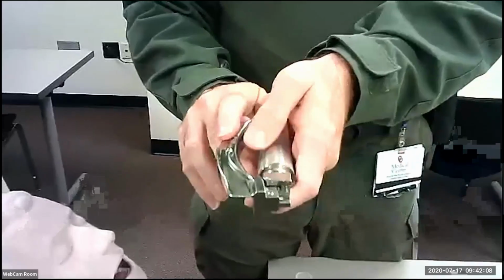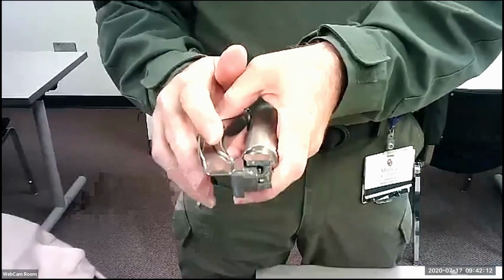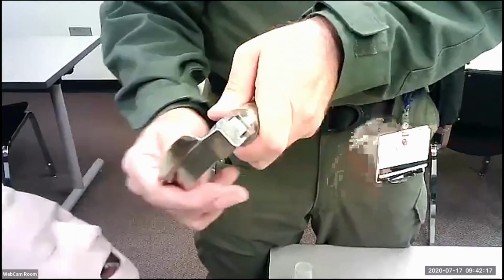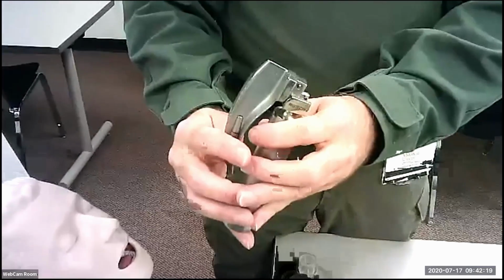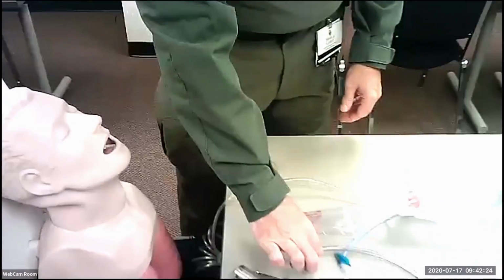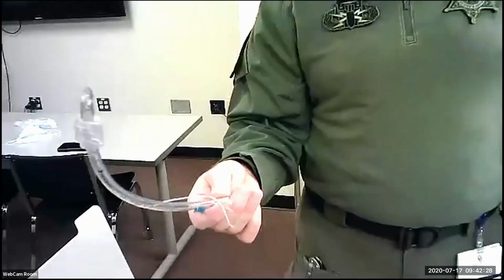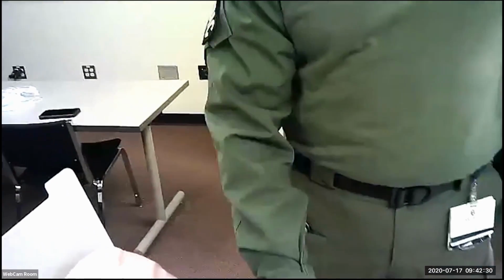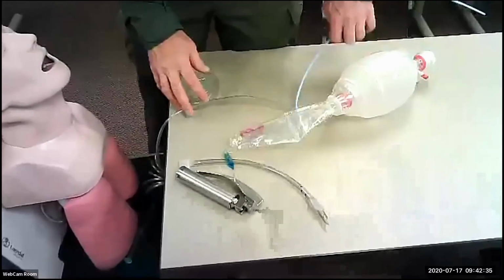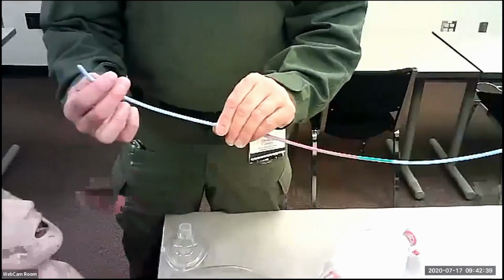The curved ones, for you PA students, are called Mac blades. The straight ones are Miller blades. I don't have a straight one out here, but it's just straight. This is a number 3. Can't see it on it. Mac number 3. That's my favorite one. Okay. Endotracheal tube. What size do we use? Most adults are going to take 7, 7.5, 8. Pediatrics, it's a specific formula, which you'll learn down the road. All right. Bougie. B-O-U-G-I-E.